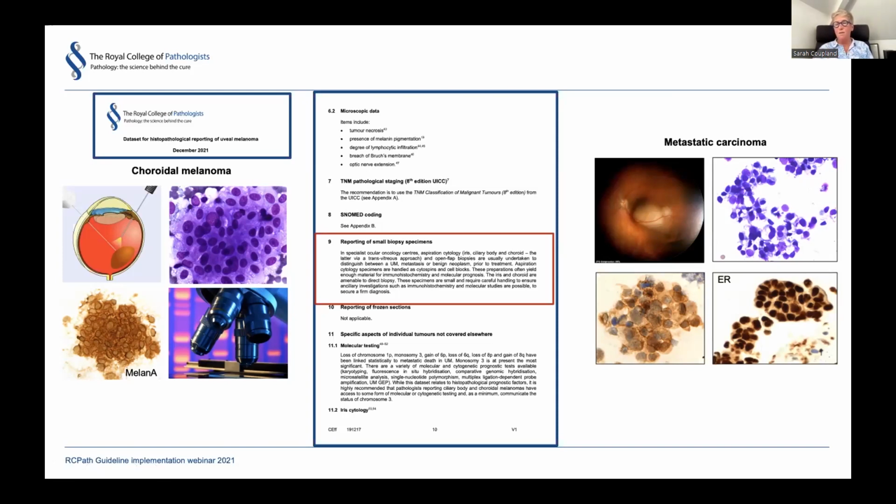In the case of metastatic lung cancer, we typically would stain for cytokeratin or TTF1. And if there is any reserve material, we would also extract the DNA to undertake any mutational testing for EGFR or the other mutations which are found in lung cancers. And this is found to be of value for patients who have widespread disease.